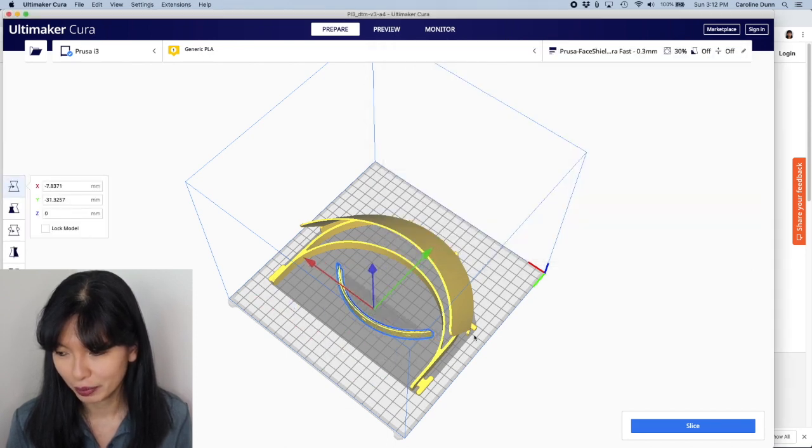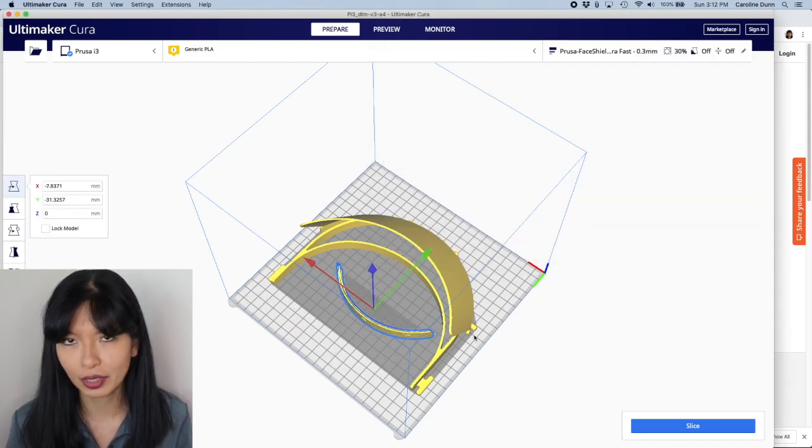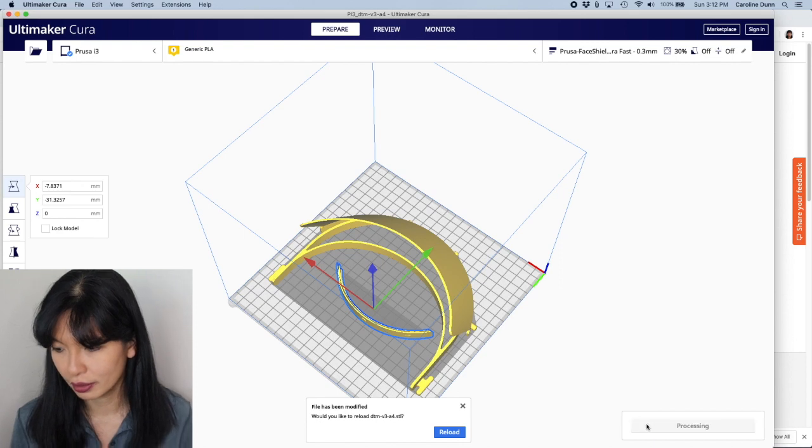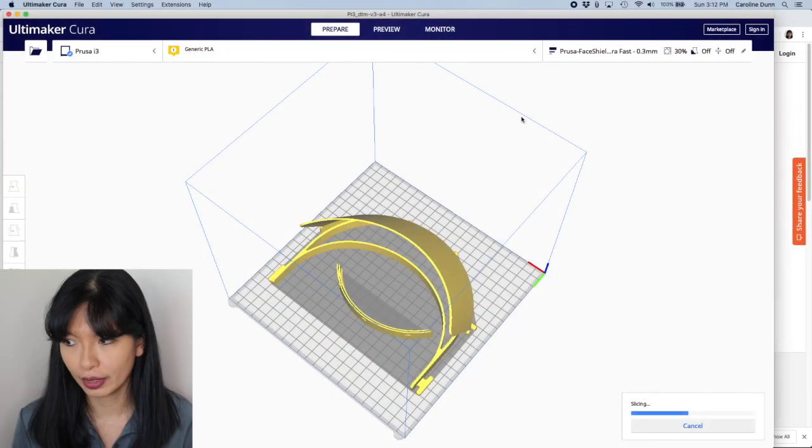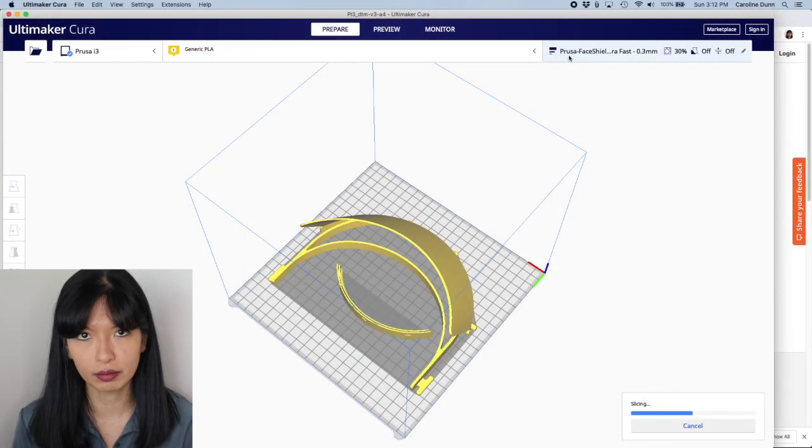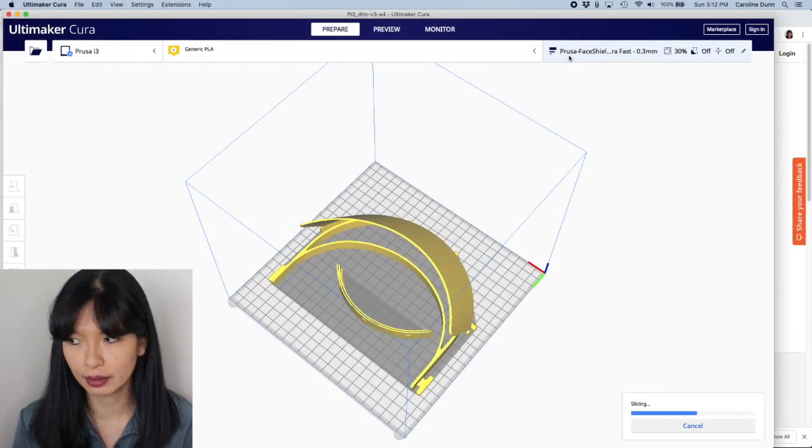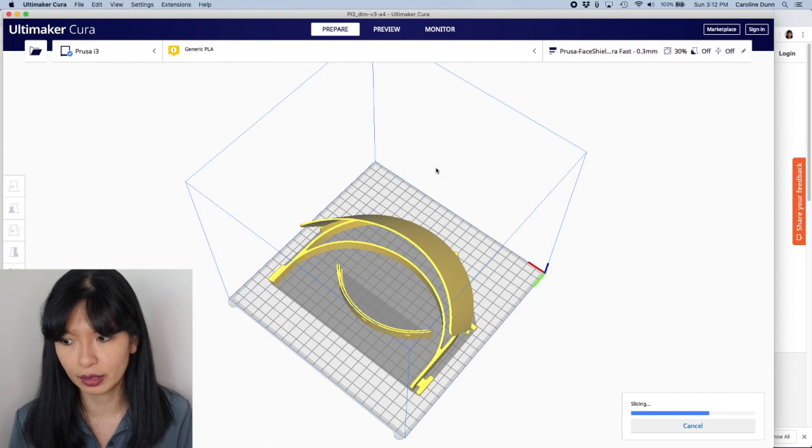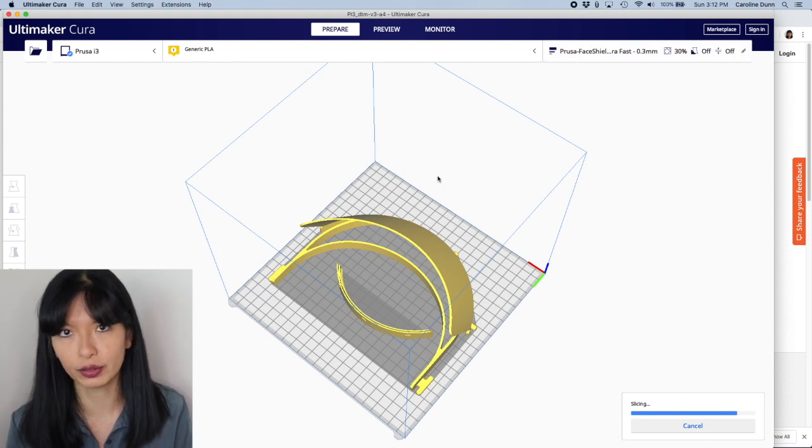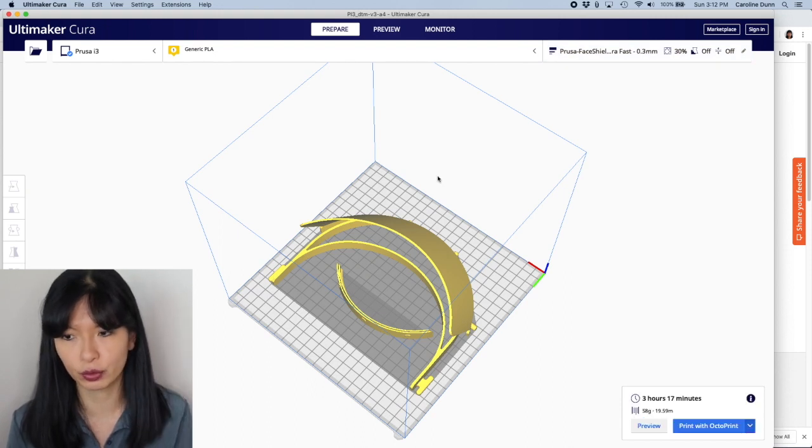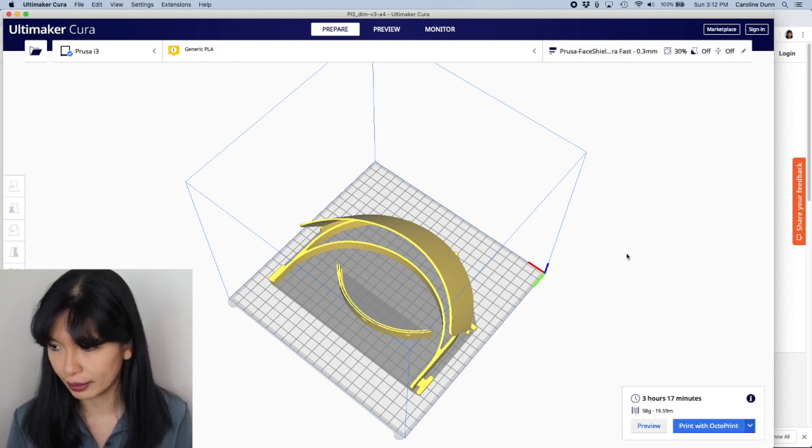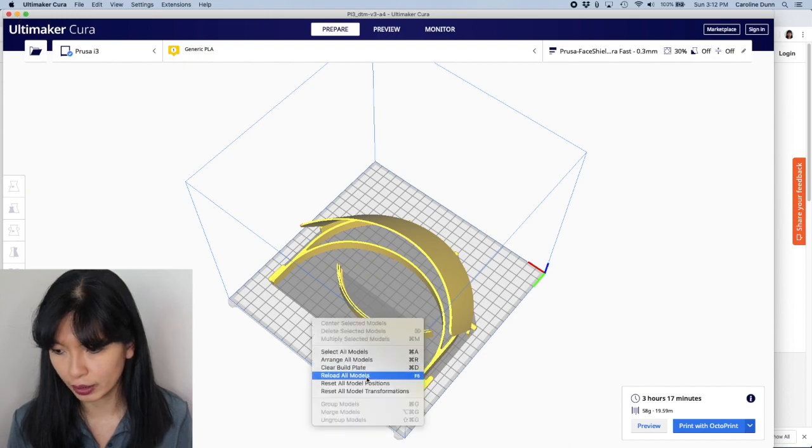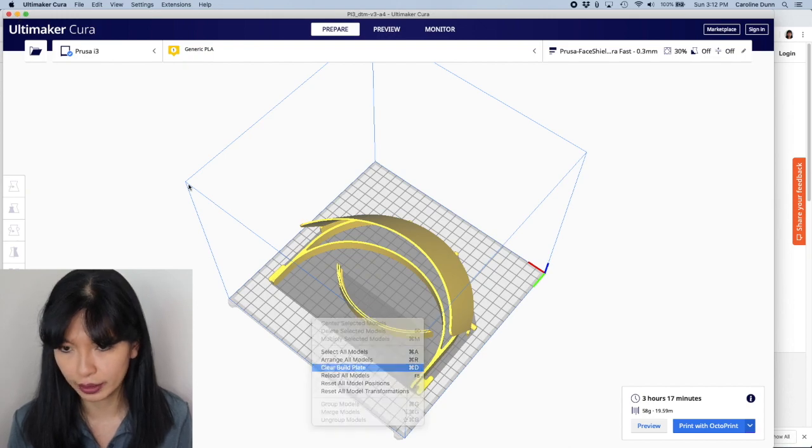Move that. Make sure it's there. And then you can hit slice and you've got your settings saved. So I believe these are the same settings, whether you print with the visor or not. That is done now.